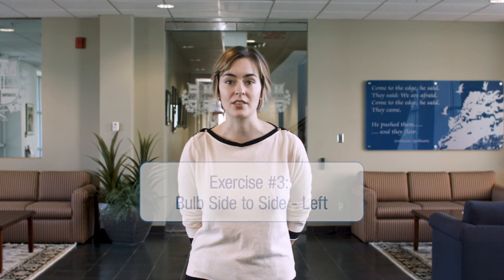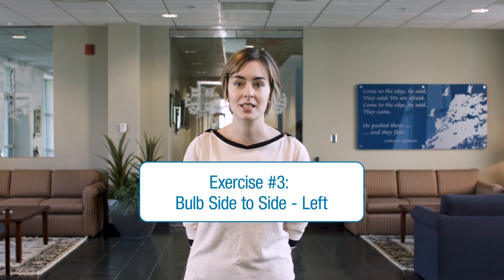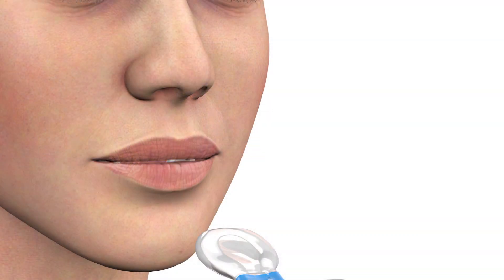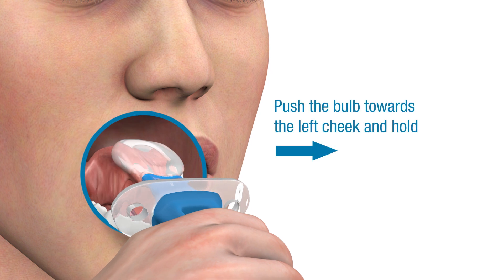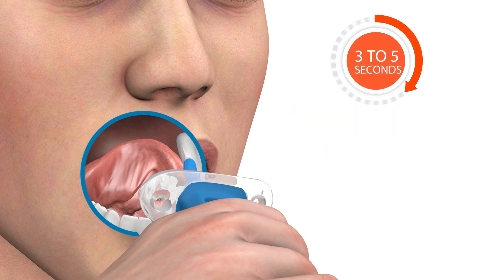The bulb side-to-side exercise is intended to strengthen and improve coordination of lateral, side-to-side tongue movements to help you with control and range of motion. Place the bulb of the Ablex device on the center of your tongue. Then, using only your tongue, push the bulb from the center of the mouth towards your left cheek and hold the bulb there for three to five seconds. The handle should remain straight.